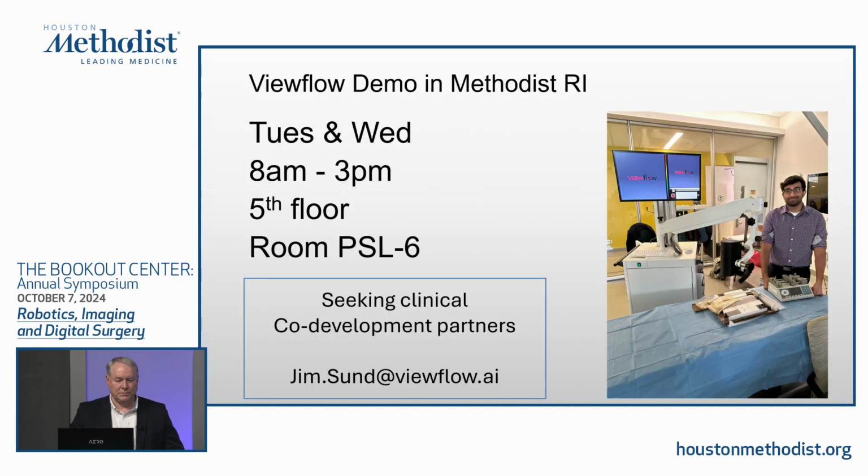Okay. I think we had a few questions coming in from our audience here. One of them was, can you actually use this to measure pressure? Very interesting concept. Yes, that's a good question. We get that a lot. I don't know. We probably need to talk to a fluid dynamics person to help us figure out how we translate. We can see the transit time speed. We can estimate the volume speed. We probably need guidance on how to convert that to assessing pressure.